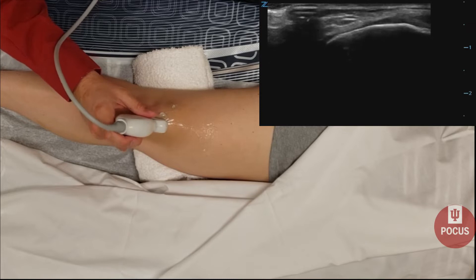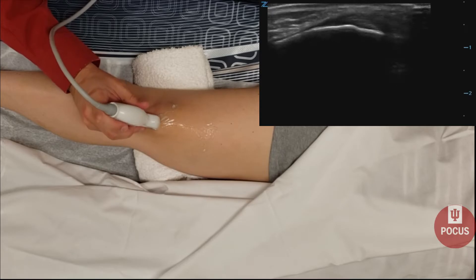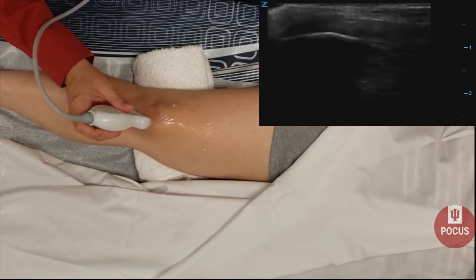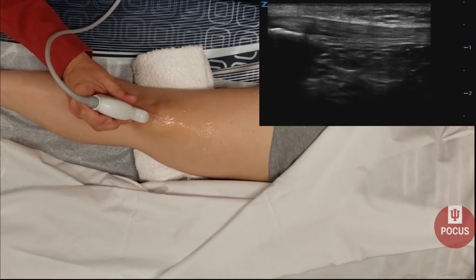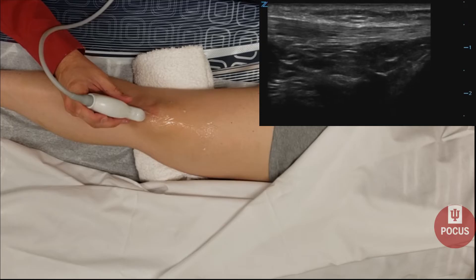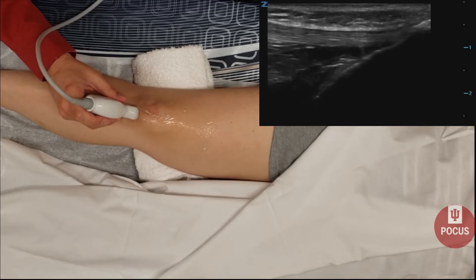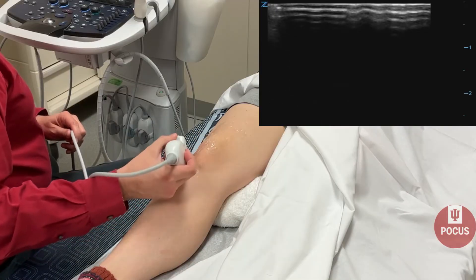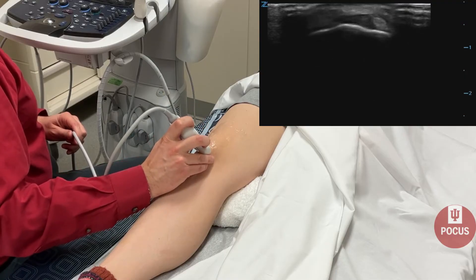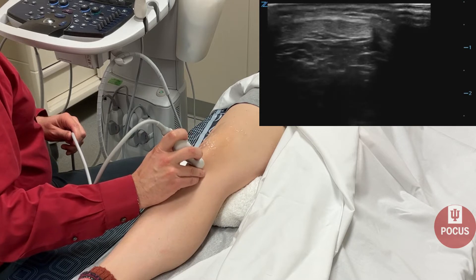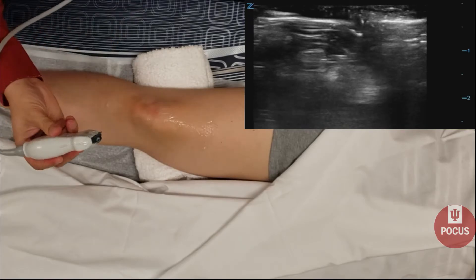Next, we'll follow the patella along for any signs of patellar bursitis or patellar fractures. Make sure to look with a lot of gel to make sure you don't squeeze any fluid out inappropriately. Then we'll look at the patellar tendon, inferior to the patella, as it goes down and inserts onto the tibia. We'll want to look at that patellar tendon both in short axis and long axis for any signs of ruptures or tears. You can also sometimes see bursitis in some of the bursa nearby.